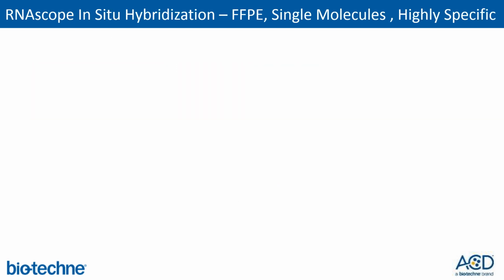The RNAscope method has three key features. The first is that it's intended for and enables detection of RNA nucleic acids in formalin-fixed paraffin-embedded tissues. It has the ability to detect and then quantify single molecules of RNA in fixed tissues, and it has a very high level of specificity, much like any extraction-based nucleic acid assay.